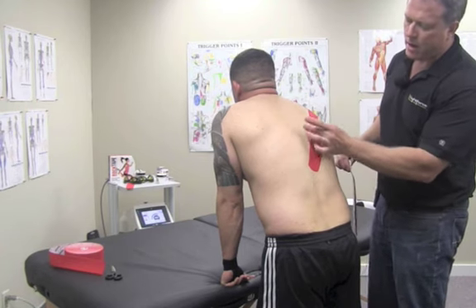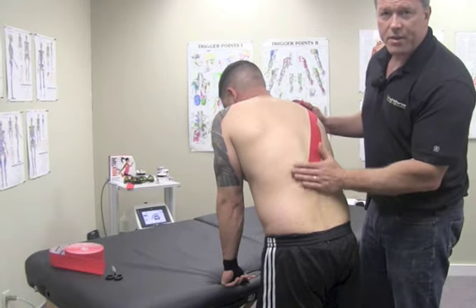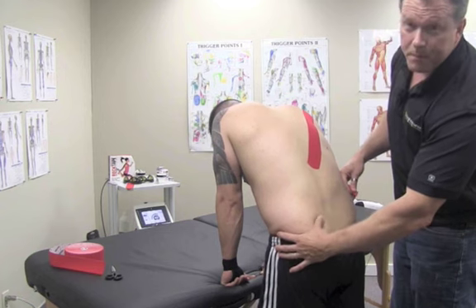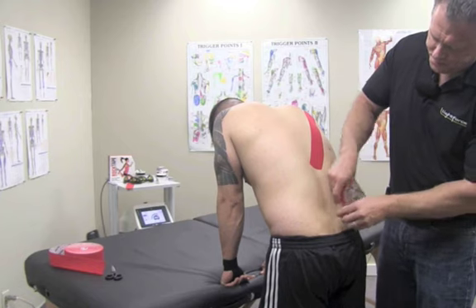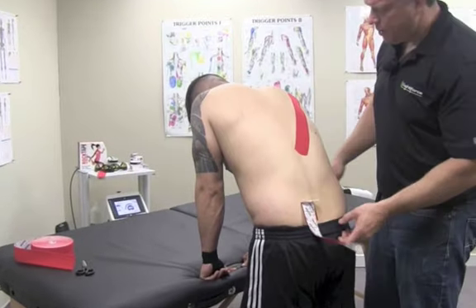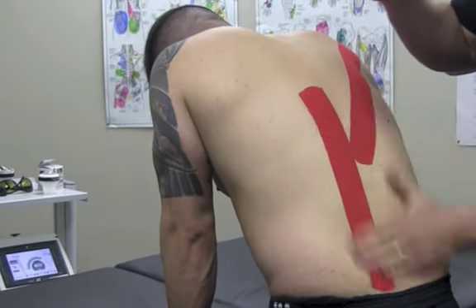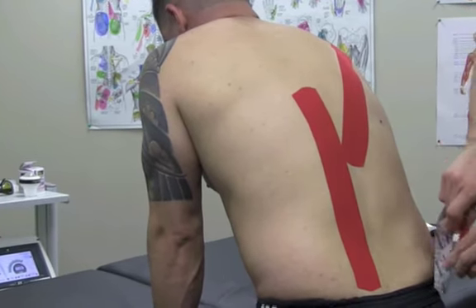This one we're going to go up and over a piece of tape that was already there, and that's okay. So you're going to actually have to round and stretch the tissue a little bit, so have the client standing up or seated so the tissue is stretched. We're going to come down so we go right below the PSIS, or down here on the sacrum a little bit. Going to lay the anchor point. Then the tape goes right up the back, just like that. Rub the tape to activate the glue. Then we're going to do the other side.